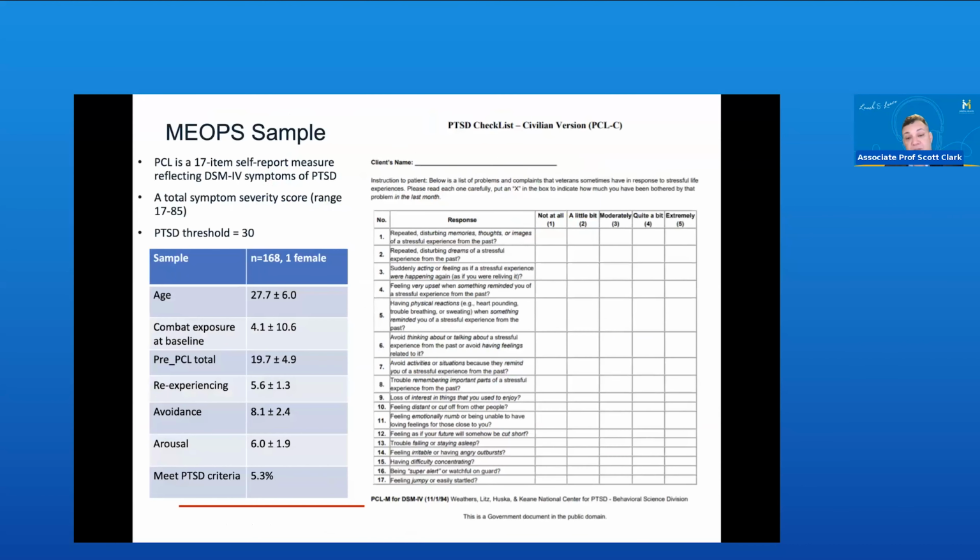EEG, there is a level of noise that is associated with the tuning of the circuit, whether the circuit is faster responding or slower responding, or suppressed or excited. And we can now mathematically remove that from standard EEG. And what we tried to do in that study is to see if that underlying noise, if the excitation inhibition balance actually changed in people with different types of childhood trauma, suggesting there were different changes in the brain.